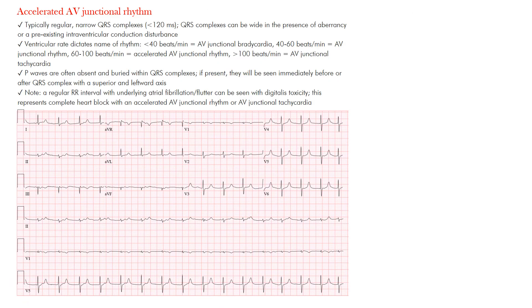Accelerated AV junctional rhythm is a typical regular narrow QRS complex rhythm, just like we saw with all our other junctional rhythms. What really differentiates these junctional rhythms from one another is the rate — specifically the ventricular rate.